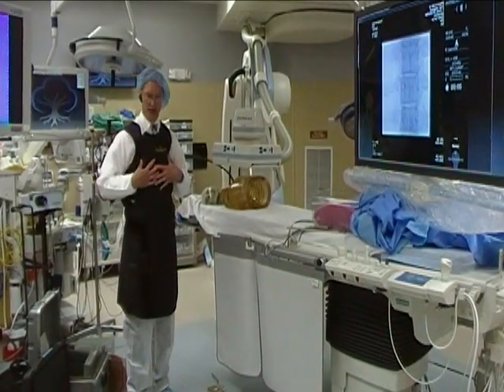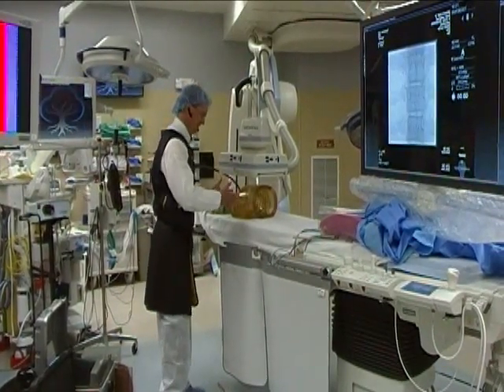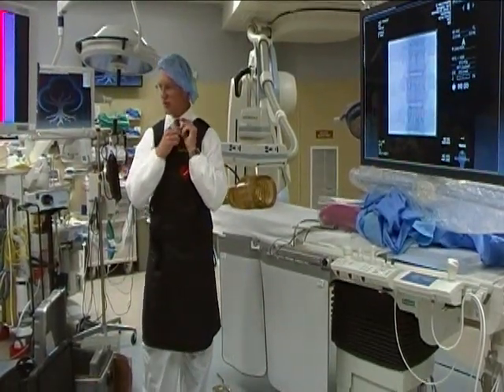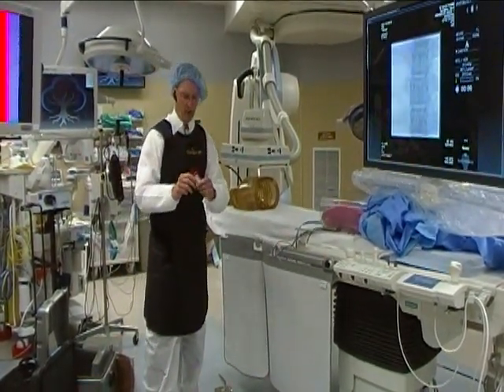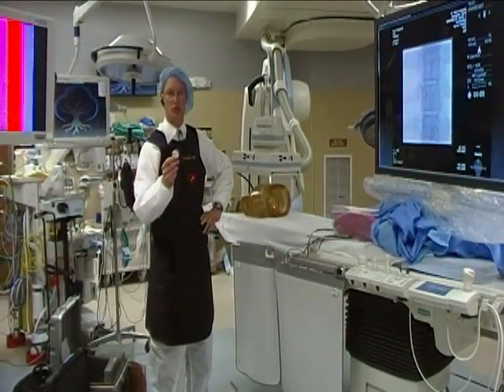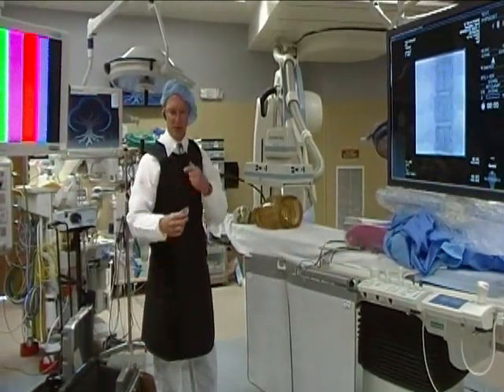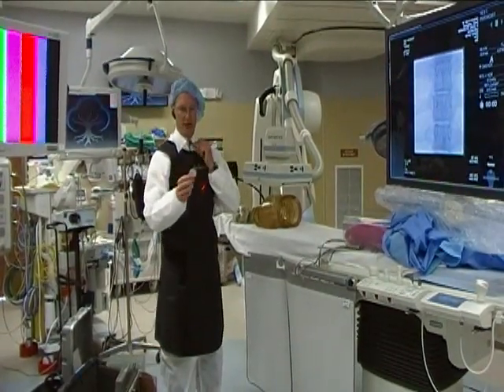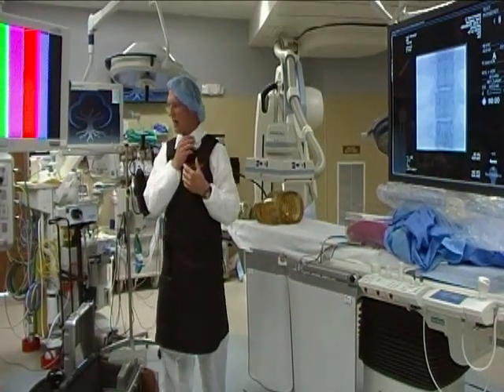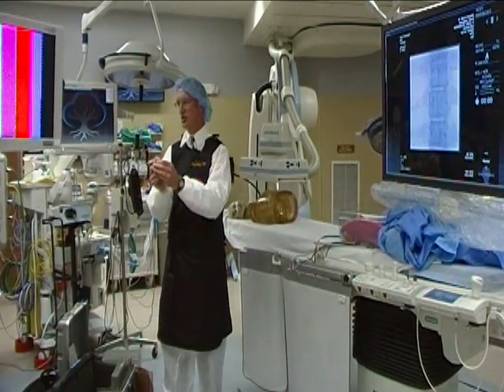Shielding is, and we mentioned that lead aprons will absorb 98% of radiation. So, you know, they stop a lot. The other thing we need to talk about are film badges. Your film badges are required to be worn outside your lead aprons because they want to measure your whole body exposure. And that includes what your eyes or face or things outside the aprons will get. So if you have one badge, it needs to be outside the apron, preferably near the collar, like I'm wearing mine. And the important thing is that your name needs to face the radiation.